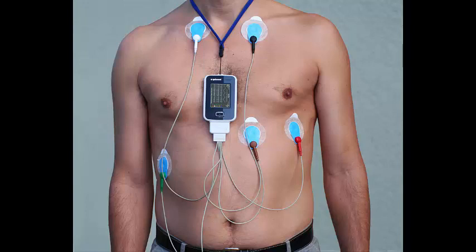These devices can also be used to assess rate control in patients with atrial fibrillation, and are sometimes used to detect transient myocardial ischemia using ST segment analysis. For patients with more infrequent symptoms, small patient-activated ECG recorders can be issued for several weeks until a symptom episode occurs. The patient places the device on the chest to record the rhythm during the episode. With some devices, the recording can be transmitted to the hospital via telephone.